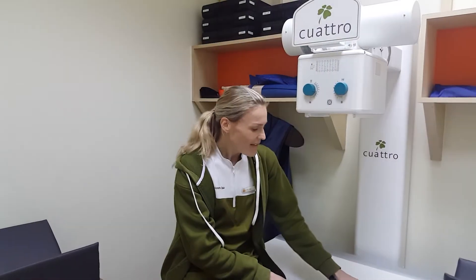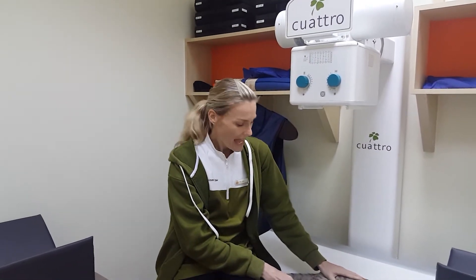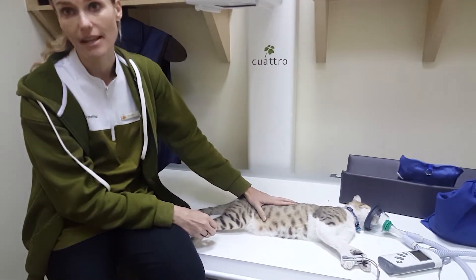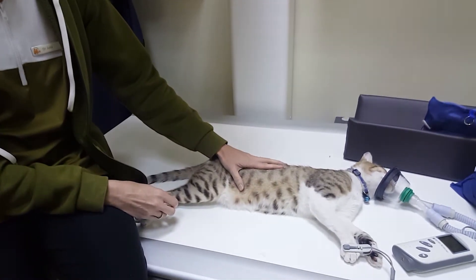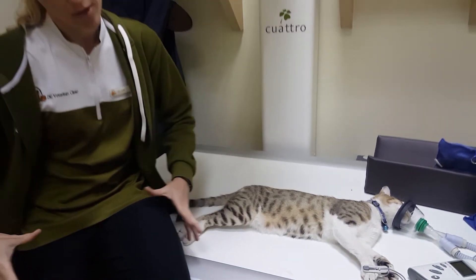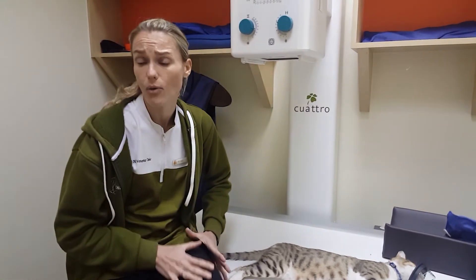Hi everyone, we have a little patient here, Carlo, and he got himself into a bit of trouble. He went missing for about five days, and now we've just been x-raying him, because on his exam he was limping on his left hind leg quite a bit.